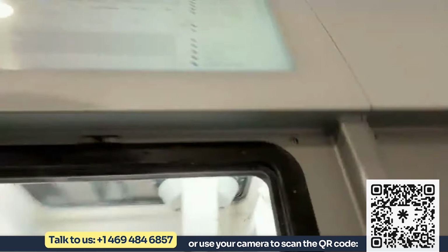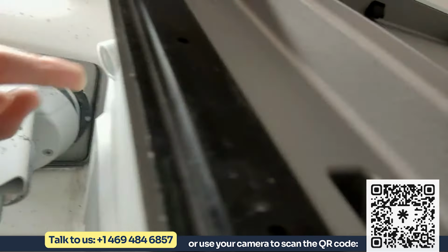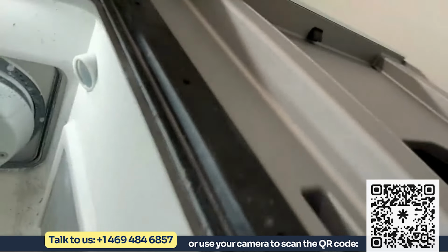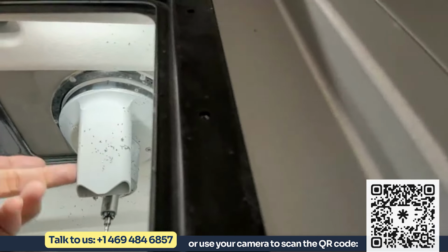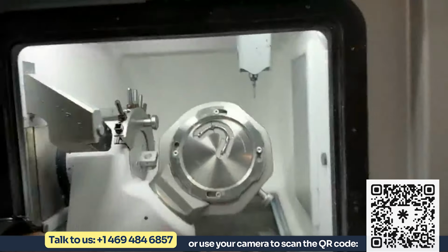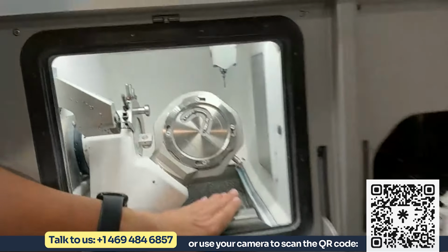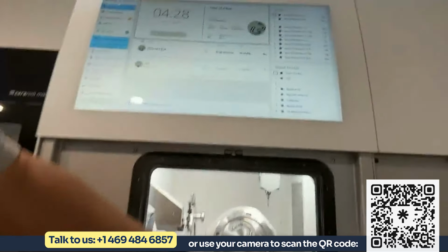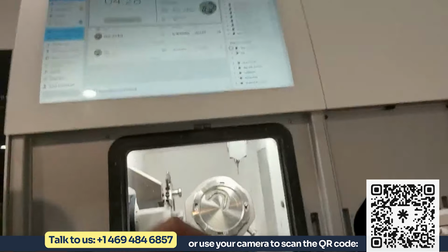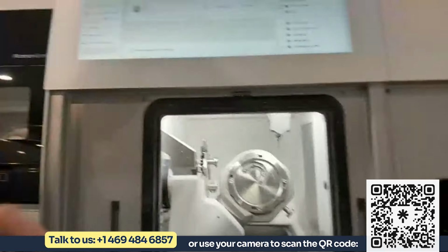One thing that I do like about this mill that we changed recently is that we put the vacuum here. Here's the camera for this mill. There's the camera up there. But we put the vacuum unit here, and what that means is it captures more of the dust during milling, which means less for you to clean as a user. So the dust gets collected here. The suction unit is the same down there, but a lot of these things are designed for lower maintenance for the user.